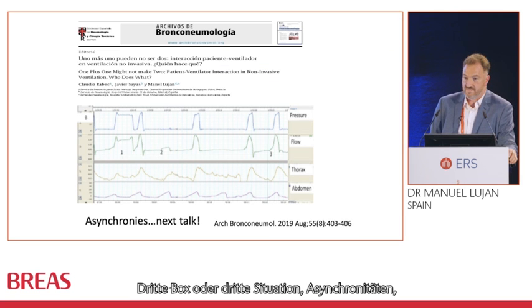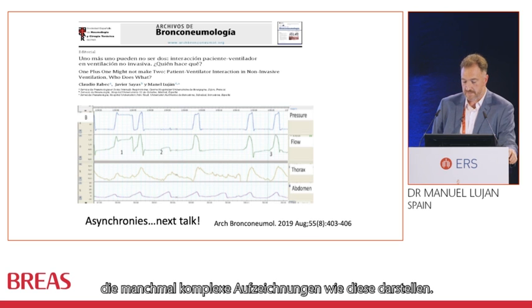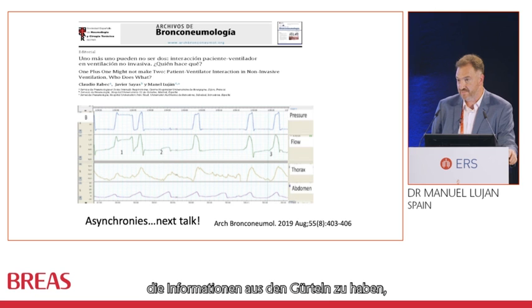Third situation, asynchronies. There are sometimes complex tracings like this. For example, look at these 3 points, in which it could also be important to have the information of the belts, but this is a topic of the next talk.